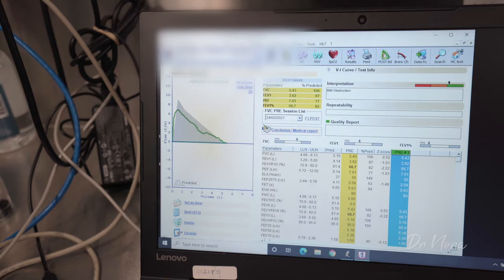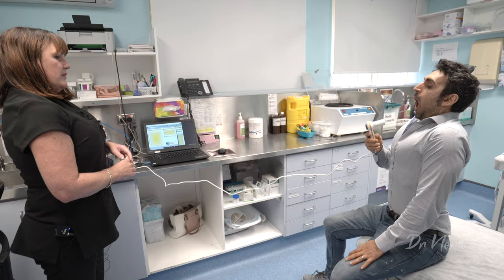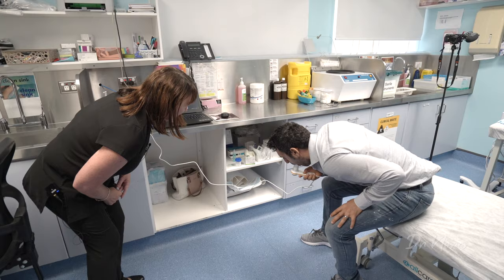But just take a fast breath, fast and hard. And go. Keep it going, keep it going. Well done.